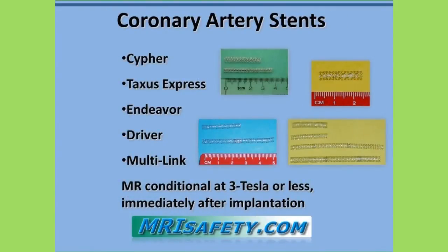MRI testing has been performed on many of the most commonly used coronary artery stents, such as the Cypher, Taxus Express, Endeavor, Driver, and Multilink stents. These tests included assessments of magnetic field interactions, heating, and a characterization of artifacts. The findings from the test resulted in MRI labeling that indicates that patients may undergo MRI exams at 3 Tesla or less immediately after these particular devices are implanted.